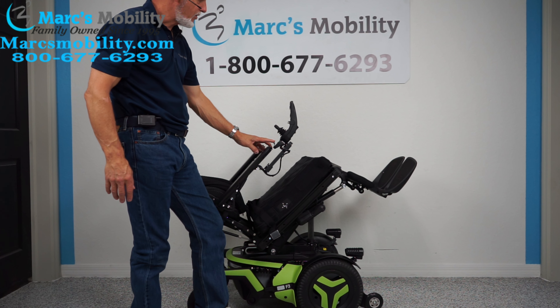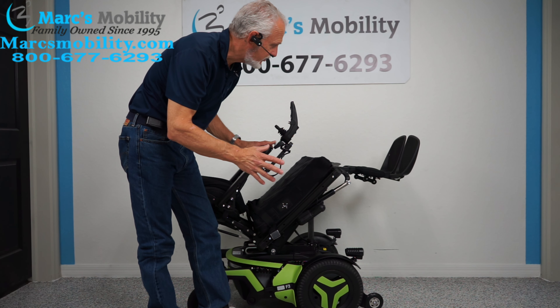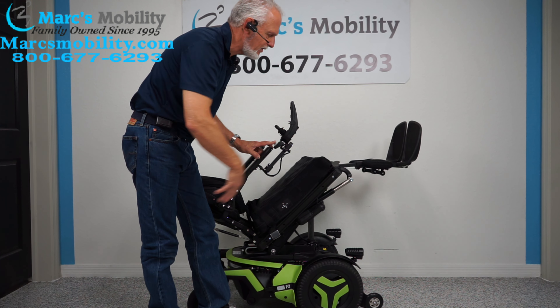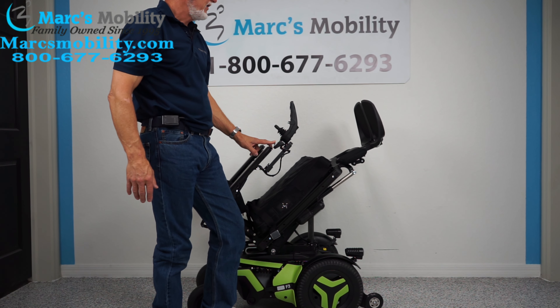The next function is called the electric legs. They're a little short right here because whoever had this chair was probably about 5'2" or 5'3", but we can let these legs out as much as you want. If you're six foot tall or five foot two, we can adjust the length of the foot plate and it would still be electric.